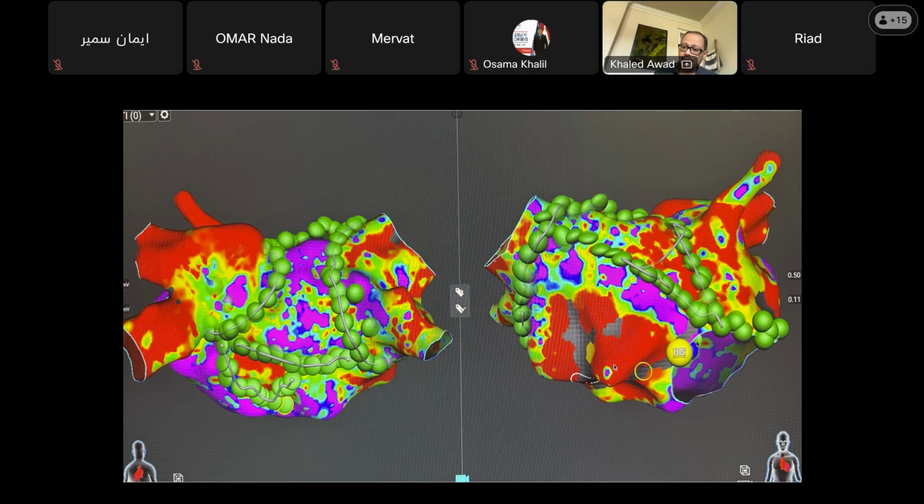The mitral annulus is one of them, and the next one is going to be the isolated veins. Or if it's a roof flutter, it's between the two isolated veins. If it is a posterior wall, it is between the two isolated veins, the roof and the inferior aspect. So lesion sets need to be closed, creating zones of block. For that you have to isolate the veins, and then you anchor things to the veins.